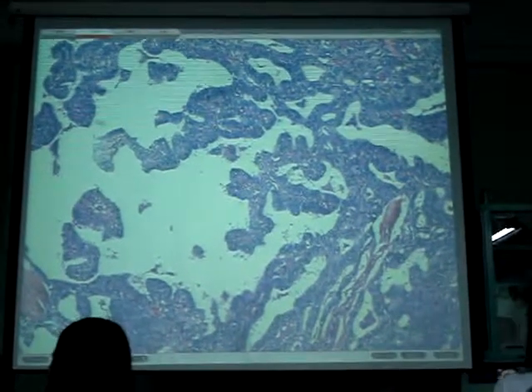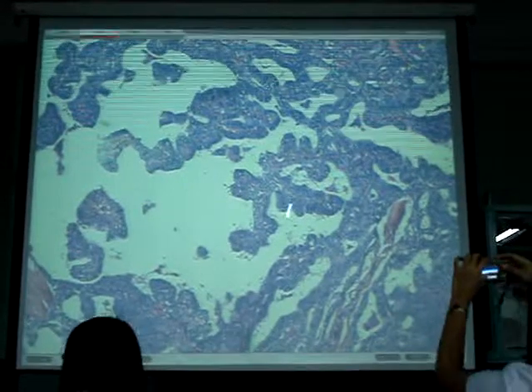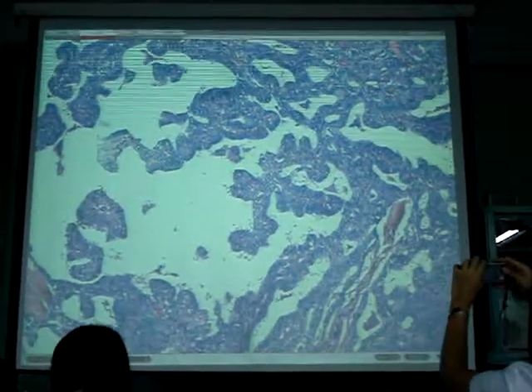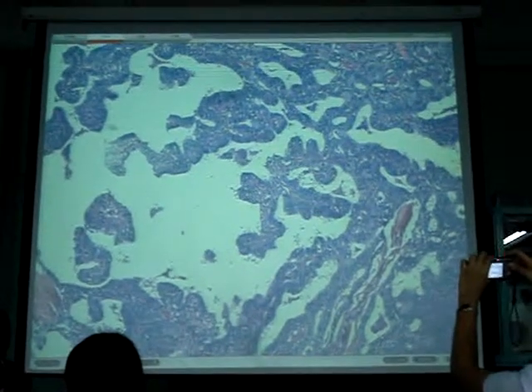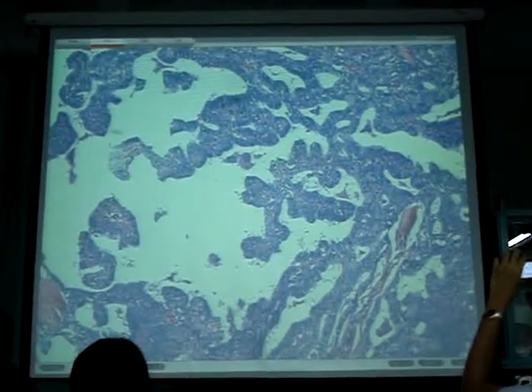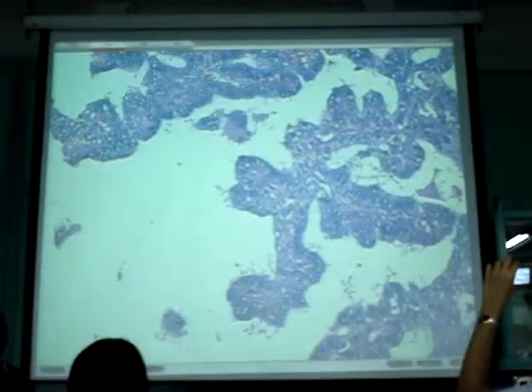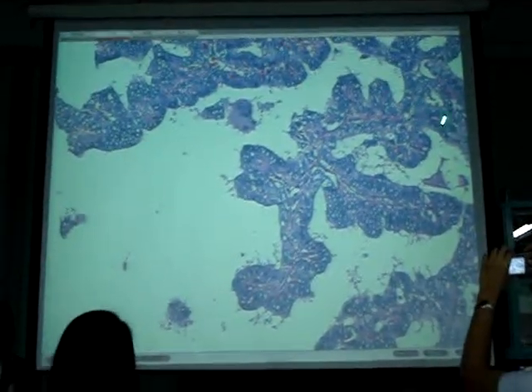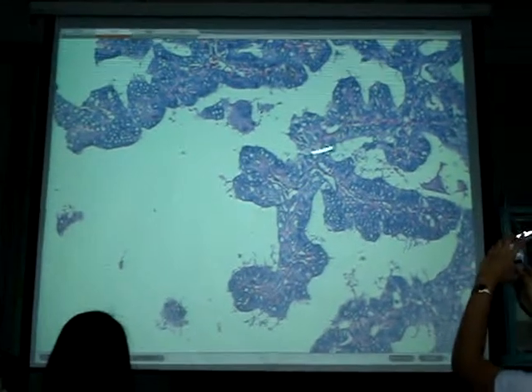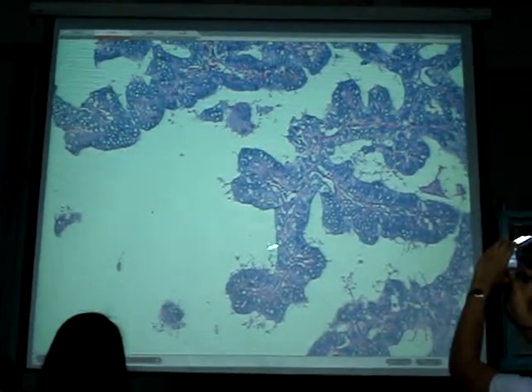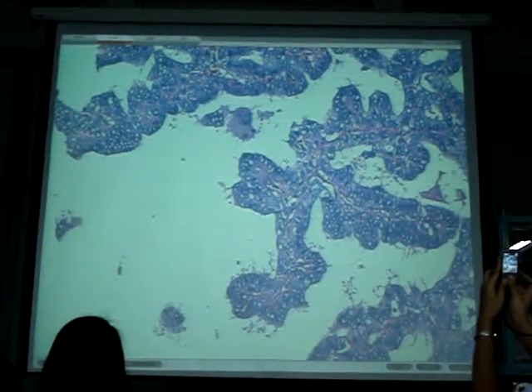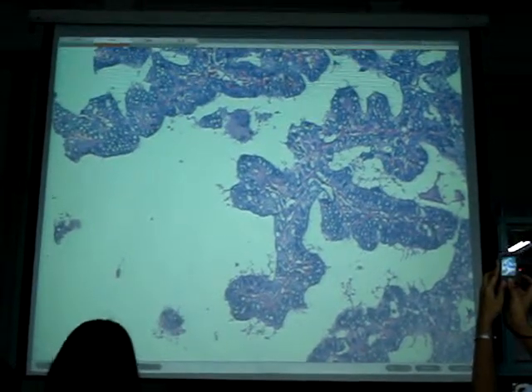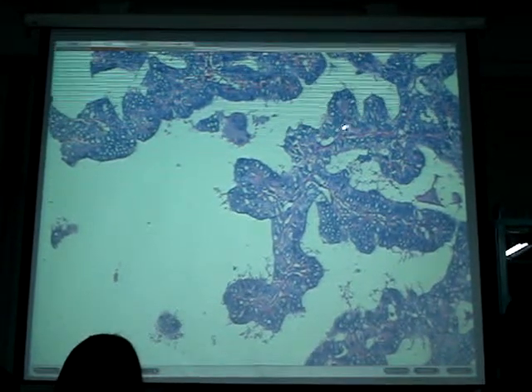If you see that tertiary papillary branching, think of papillary carcinoma. Another architectural feature: the papillary formation is supported by a fibrovascular stroma — fibrovascular, meaning fibrosis with blood vessels.